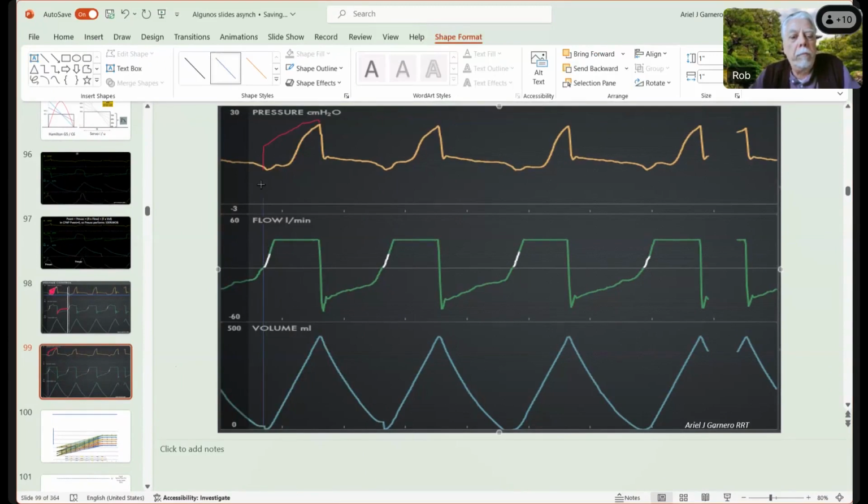Yes, some people might say that the previous option, the adaptive flow, would bring a little bit more comfort. But in many ways, we can appreciate the same kind of degree of work shifting. The problem is deciding if the work shifting is tolerable, and I don't see that as severe. But I agree that maybe switching to a pressure control mode would provide more comfort, but maybe at the expense of a higher tidal volume. Right, and we still have the issue of the late cycling.